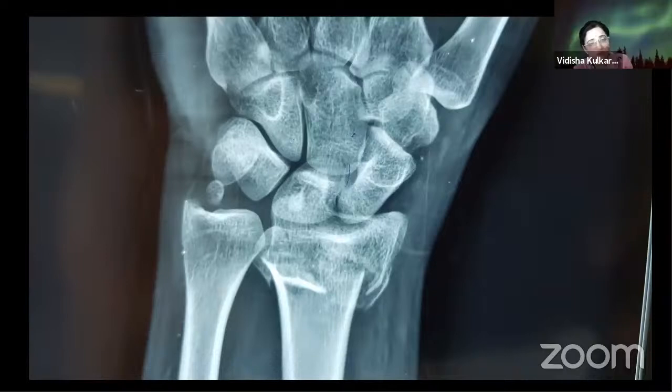All right. So, Abhijit, just to go back. Can you go back? Yes, sir. It's obvious that there is shortening of the radius and the radial displacement of the lower end radius. So automatically, the sigmoid fossa fragment has pulled the styloid with the TFC by the corresponding amount of distance. The one thing that is just staring at us is the shortening of the radius and the radial displacement, both of which indicate that at the end of all the radial-sided fixation, one would have to address the ulnar side after evaluating the stability of the distal radial ulnar joint after you achieve stability of the radial side.